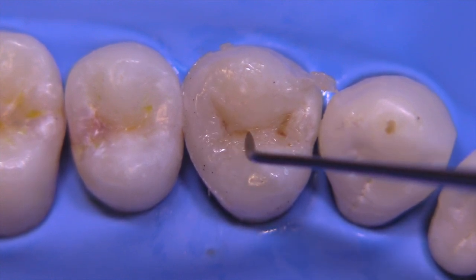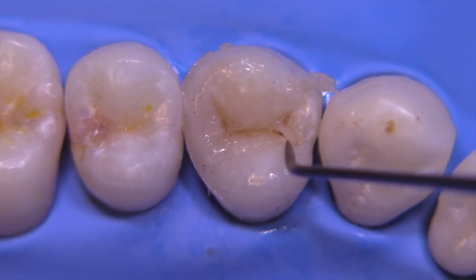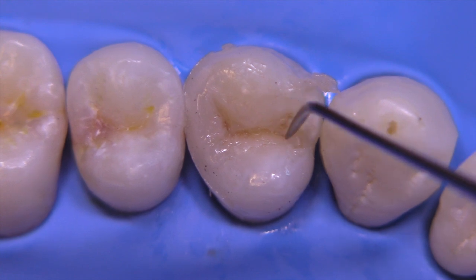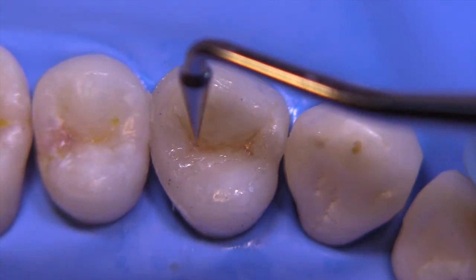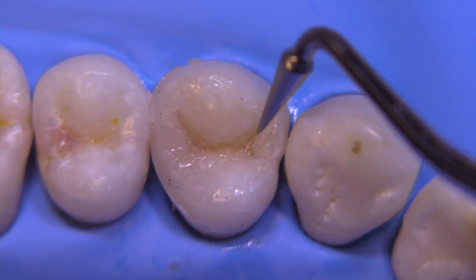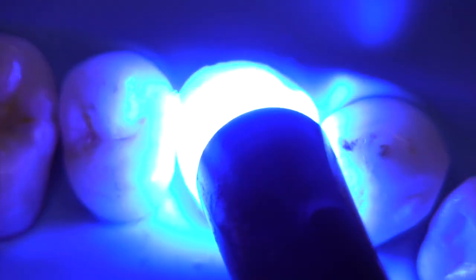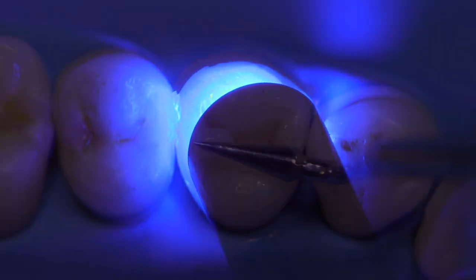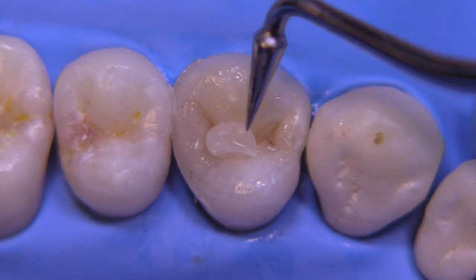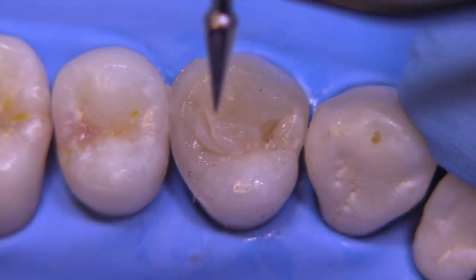This is the important final step where you need to make things look appropriate for the particular tooth you're working on. Take your time, and keep the operatory light or your headlamp away from the area where you're working so you don't prematurely cure the composite resins. We'll light cure this layer and then build one more layer to bring it nearly to full contour — still slightly under-contoured.